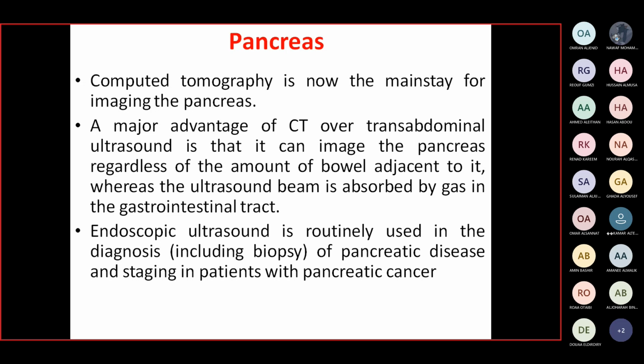If we have suspected trauma, injury to the pancreas, or acute pancreatitis, it can be demonstrated by ultrasound, but CT is the imaging modality of choice for assessment of the pancreas. The major advantage of CT over transabdominal ultrasound is that ultrasound has limited use in areas containing gas. Ultrasound propagation in any area containing gas is very poor.